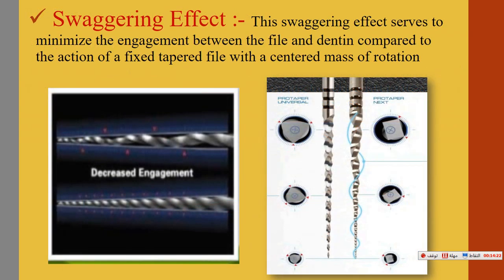Another improvement is the movement. Unlike the previous universal or manual systems which use continuous rotational movement, ProTaper Next uses a swaggering, snake-like movement. This minimizes dentine contact, reduces stress on the dentine, reduces cracks and dentine weakening, provides more space for debris removal, and decreases engagement. The movement of the file is very important in the shaping ability of the instrument.